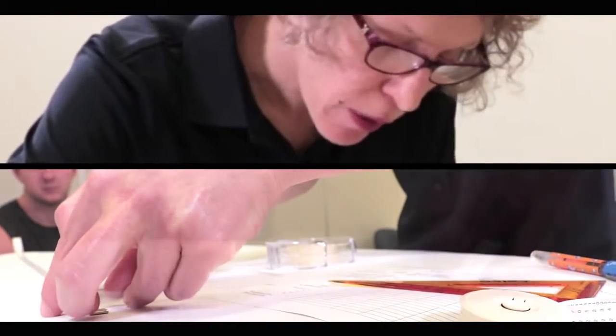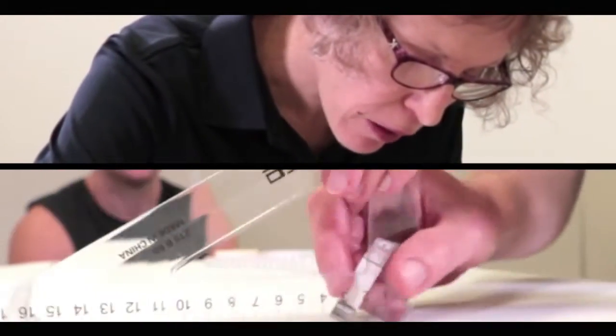If you do not have access to a measuring board, you can apply the principles already shown to achieve a reproducible limb position. For example, secure two tape measures parallel to each other on a height adjustable plinth.